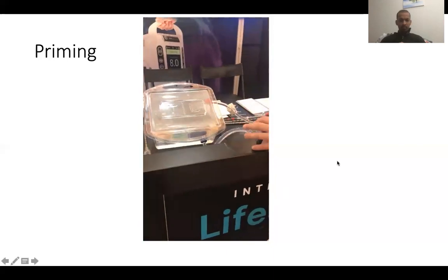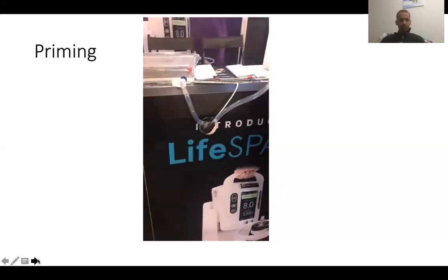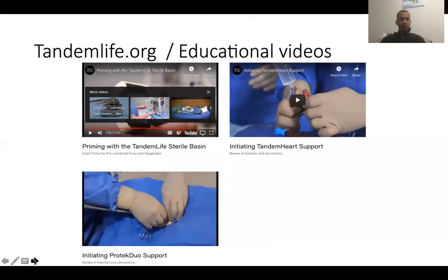When you start someone on circuit, it takes a lot, and everyone's nervous. Battery life is somewhere around 60 to 90 minutes, so it's easily portable from one hospital to another, from a site to an ECMO site. And they have wonderful educational videos.